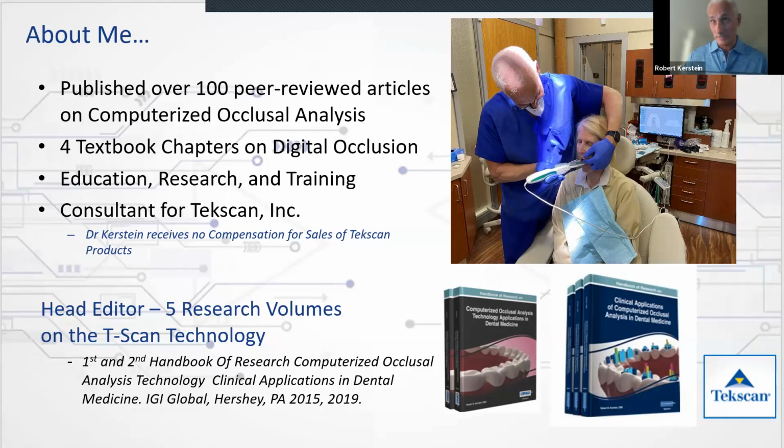If you're interested in learning more about the TScan after tonight's seminar, these 5 volumes have a tremendous amount of information in them about all aspects of TScan, not only the force versus time graph, but TScan in orthodontics, TScan in prosthodontics, TScan in implants, TScan in general occlusion, TScan in TMD. And these are available from the publisher IGI Global, and they would really help anyone who's interested in learning a specific TScan discipline.